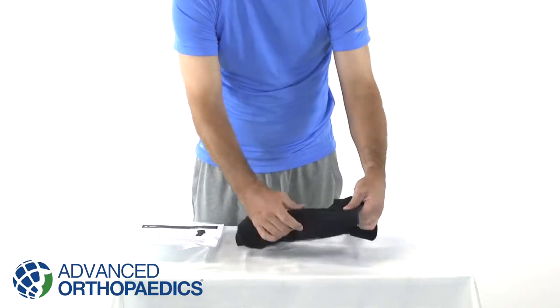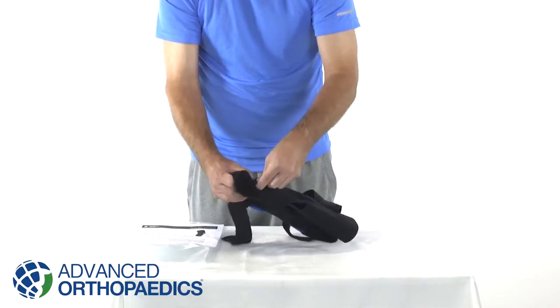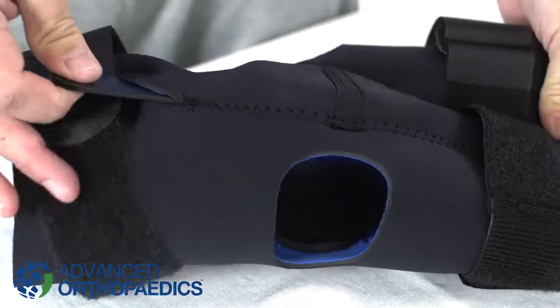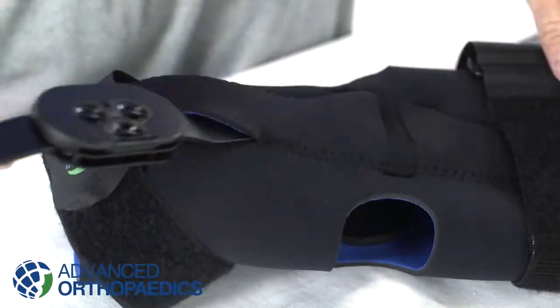To apply the brace, open the front straps and lay the brace down on a flat surface with the outside facing up. Remove both hinges from their respective sheets via the opening located just below the closure straps.